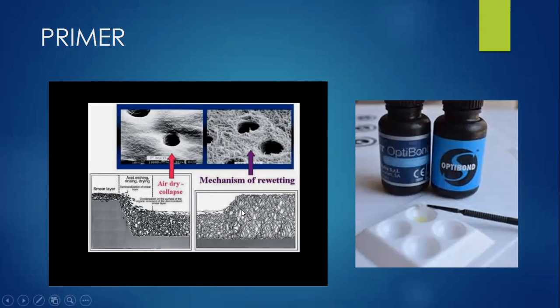remaining solvent. So after applying the primer, we can put a little air blast over it to remove any remaining solvent. Because any residual presence of solvent will lead to centrifugal movement of the dentinal fluid within the monomer and may reduce the amount of monomer infiltrated in the collagen network. Because whenever it is over dried, the water from the dentinal fluid will come on the surface and not allow the monomer to interdiffuse. It's very important to remove the excess solvent.